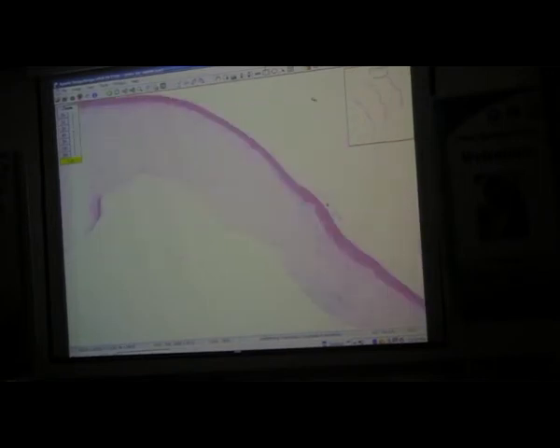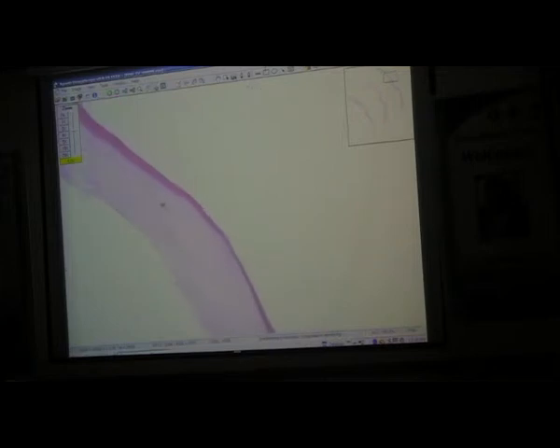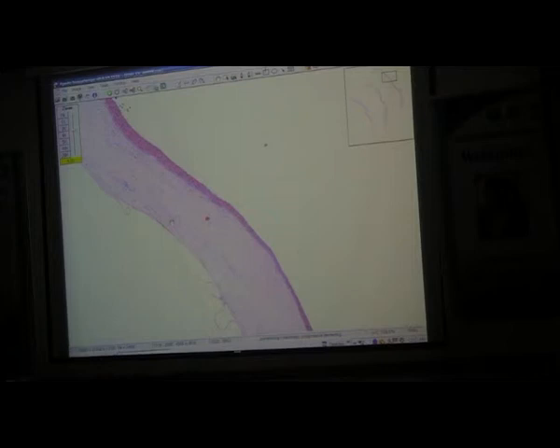And now, we can do a lot of things with this. I was thinking to myself, how can I do some extra teaching? And now we have something else. In this, there are so many things going on here. This red dot, by the way, is an artifact. You wonder if, in fact, the cornea might be thin. So, disruption of Bowman's layer, thinning of the stroma. What do you think? Keratoconus. Yeah, I would say keratoconus.